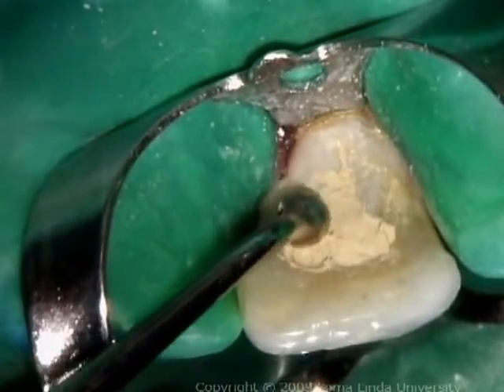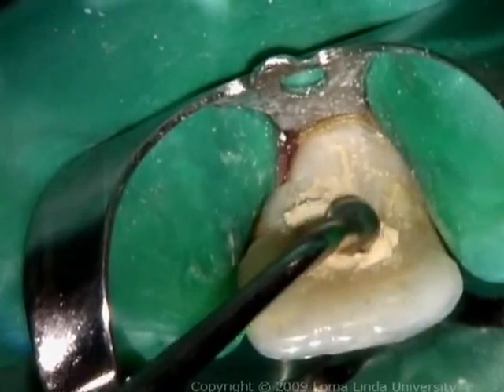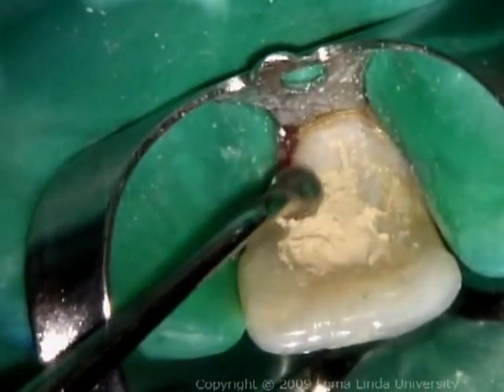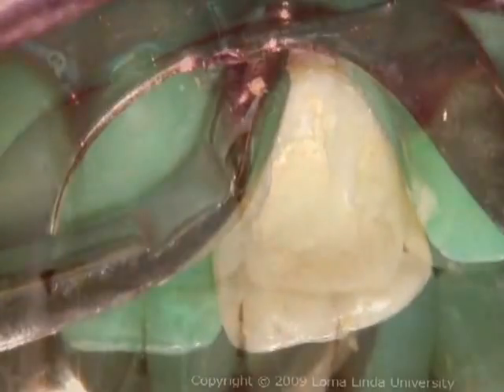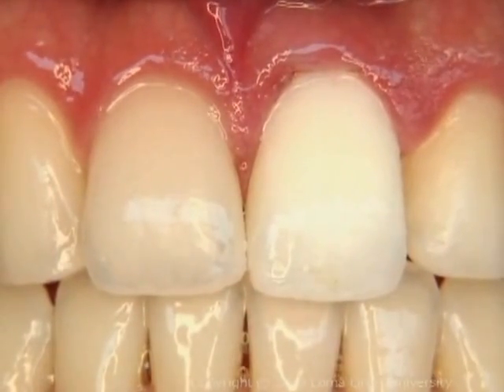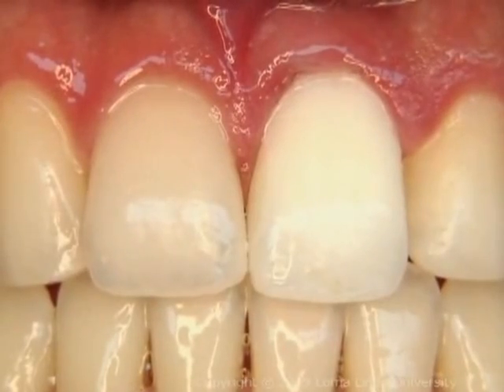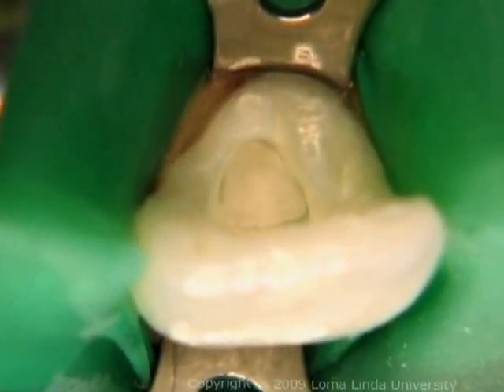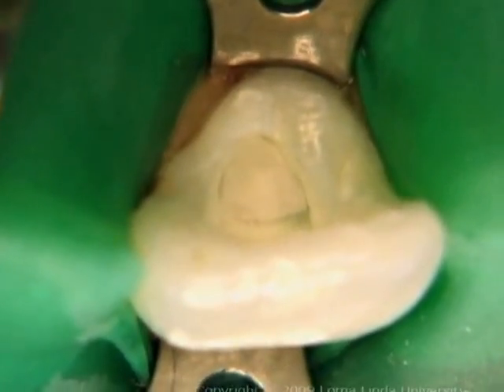A thick paste of cavit is packed carefully to a thickness of at least three millimeters to ensure a good seal. The rubber dam is removed and the patient is scheduled to return weekly to check the results of the treatment. After achieving adequate bleaching, the pulp chamber and the access cavity are restored with a combination of zinc phosphate cement and a light-cured acid-etch composite.